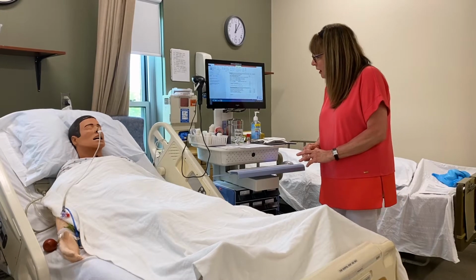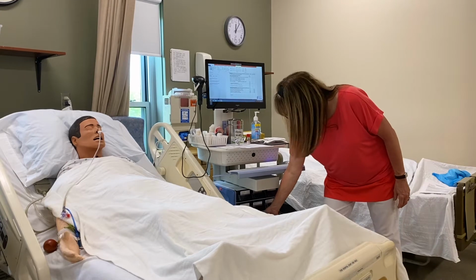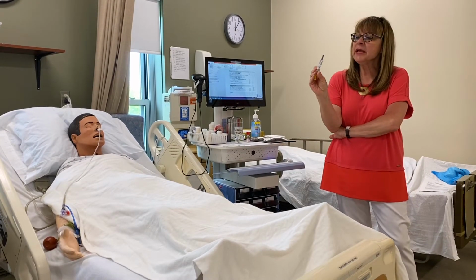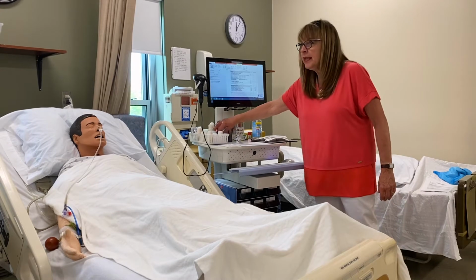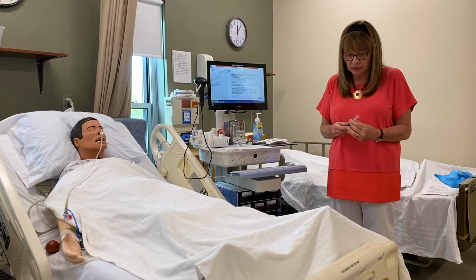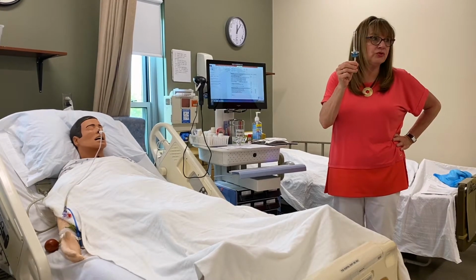parenterally. We also have some medications that come all pre-measured to go, like this medication here, which we're going to be giving today. And then sometimes we have medications that come in pre-filled cartridges, which I'm sure you already talked about in your lecture. And in order to engage those, we have to put them in a cartridge.